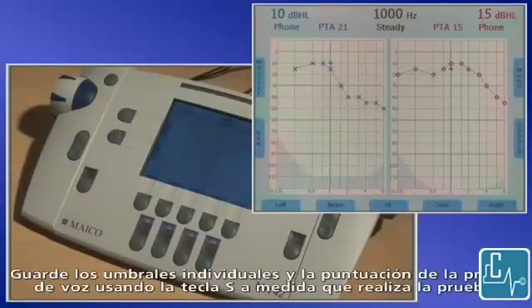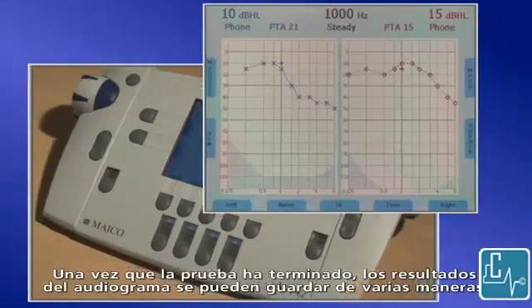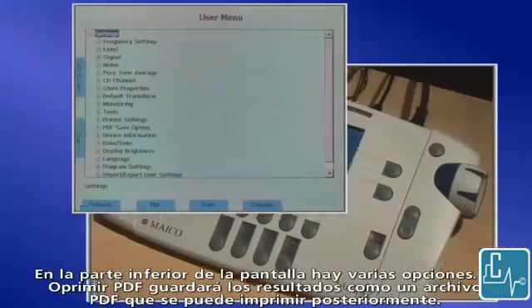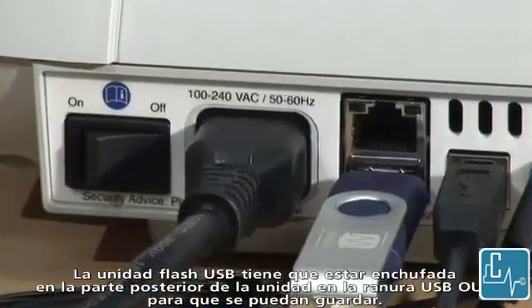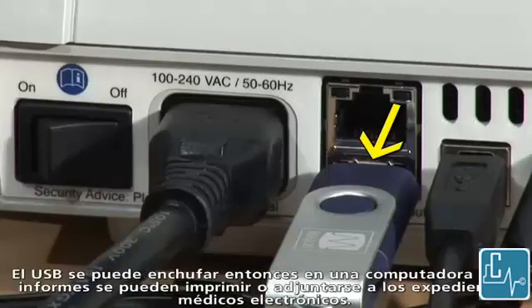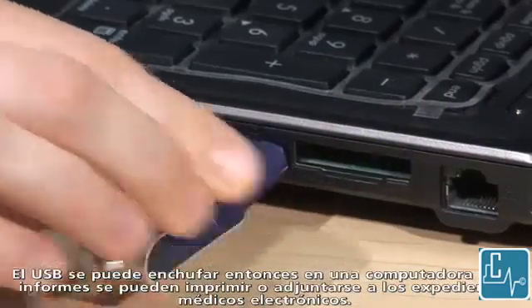Save individual thresholds and speech scores using the S key as you conduct the test. Once the test is finished, the audiogram results can be saved in several ways. Press menu. At the bottom of the screen are several options. Pressing PDF will save the results as a PDF file that can be printed out later. The results are saved by default to the USB memory stick. The USB stick must be plugged into the back of the unit in the USB out slot in order for them to be saved. The USB can then be plugged into a computer and reports can be printed or attached to electronic health records.